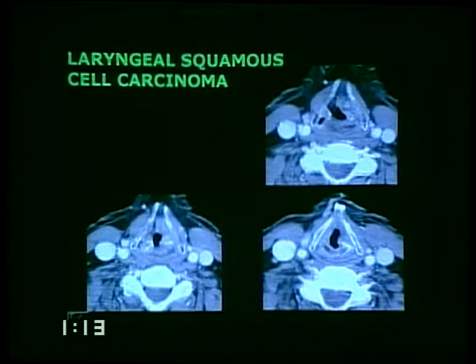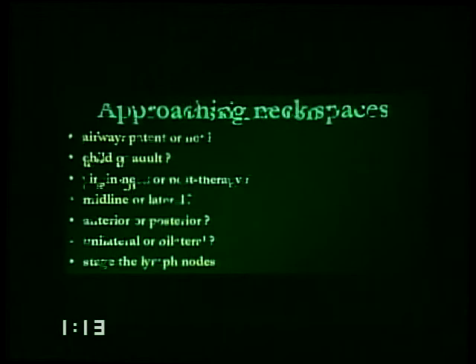Squamous cell carcinoma violating the fat, and that's the clue. You're going to look at the cartilage in even greater detail on fat-suppressed MRI with contrast. If the cartilage enhances, it is abnormal cartilage, it has been violated, you're upstaging the patient. Again, you're looking at indirect evidence around it.